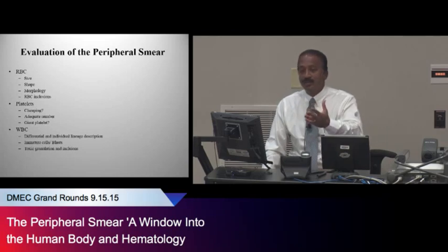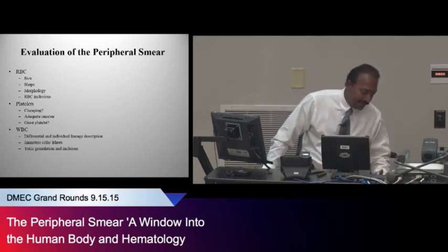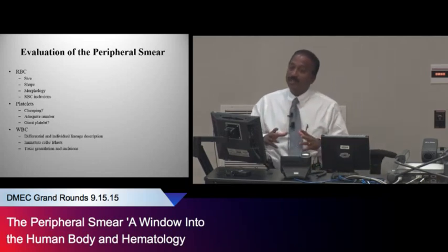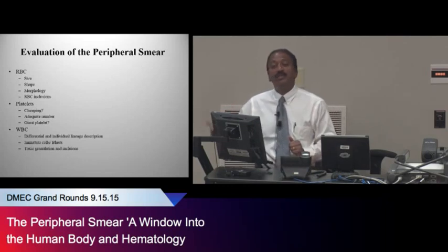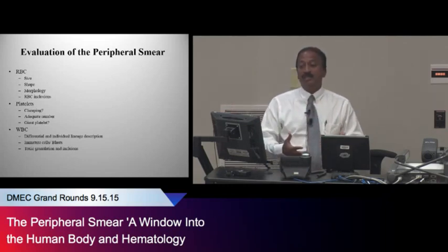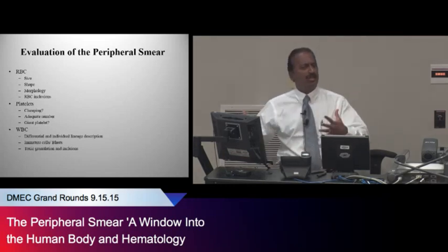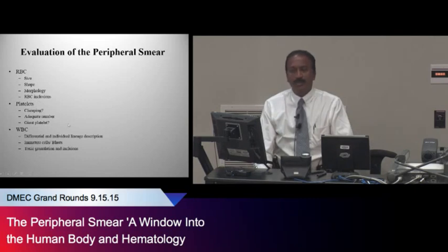So when you guys call us for a consultation for thrombocytopenia, and we're worried about HIT and other things, and I go look at it and I see some larger platelets and giant platelets, I know that marrow is working. It's spitting out early platelets into the circulation. And I know this could be ITP. And so in ITP, you'll see some larger platelets and giant platelets. So this is not all theory. This is exactly what you would see at the bedside and in the lab to apply to your patients.